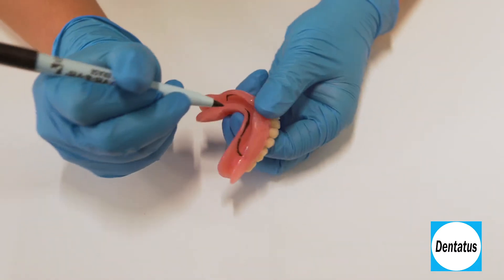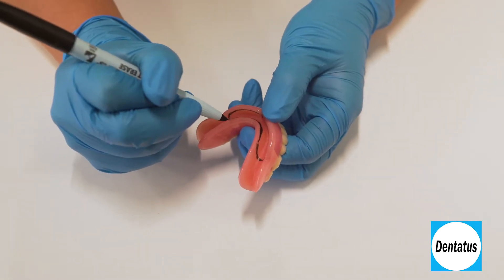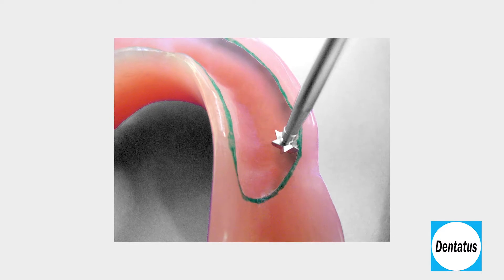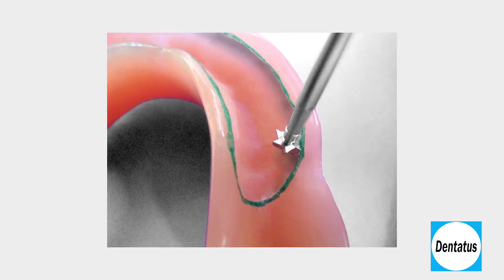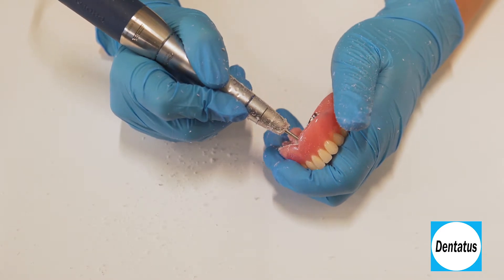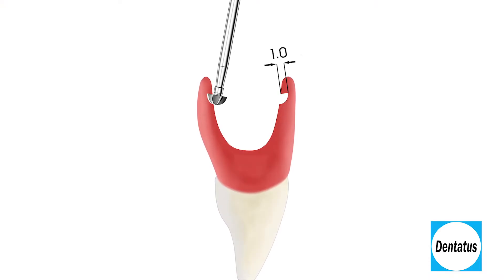All of the denture preparation instruments are depth-gauged to create a one-millimeter trough, so take the instruments to their shank with light pressure to ensure the trough is prepared to the right depth. Using the half-round denture preparation instrument, create an undercut around the entire periphery of the delineation, including the distal extension. The instrument should be angled 45 degrees to the opposite flange and taken to the shank to ensure the one-millimeter thickness that will lock the liner in position.